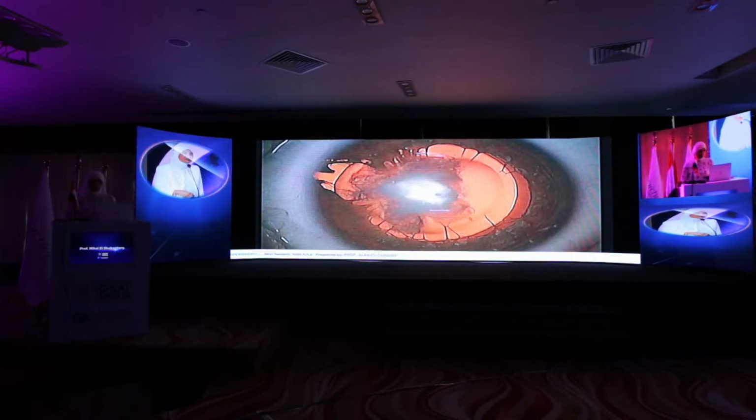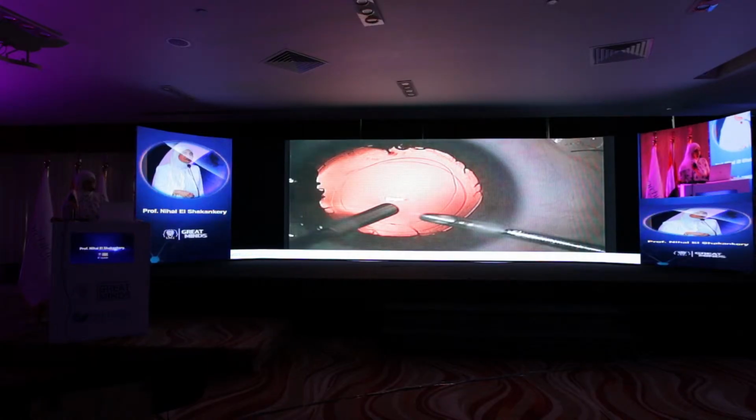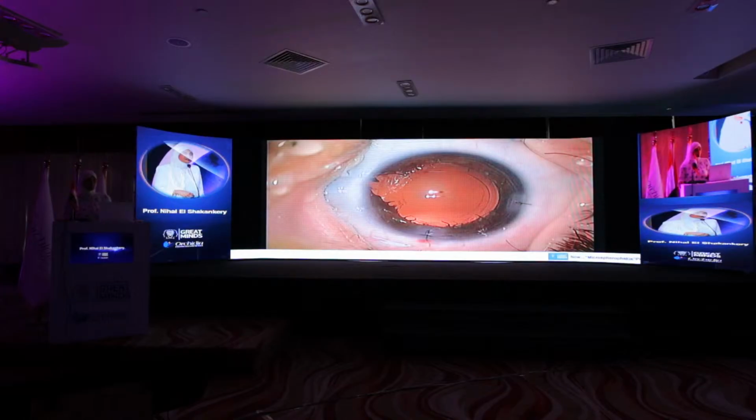However, in cases of microphakia, as in this case, we still go for a conventional surgery. We go for the anterior capsulorhexis and posterior capsulorhexis together with anterior vitrectomy, and finally close the wound as if we are performing a straightforward pediatric cataract surgery.